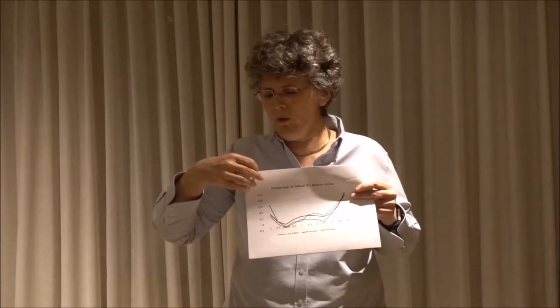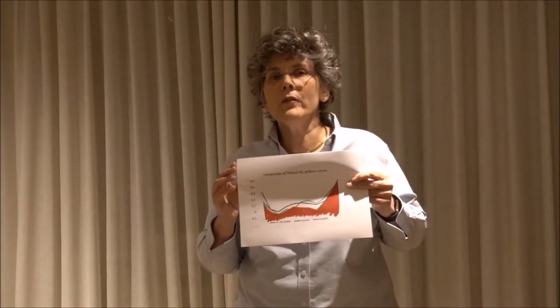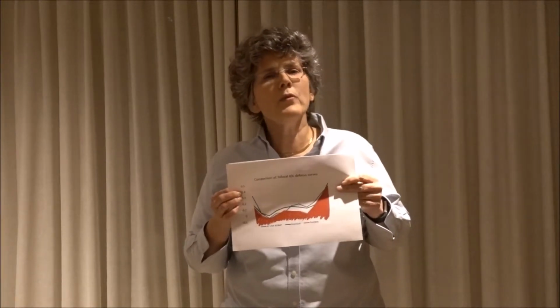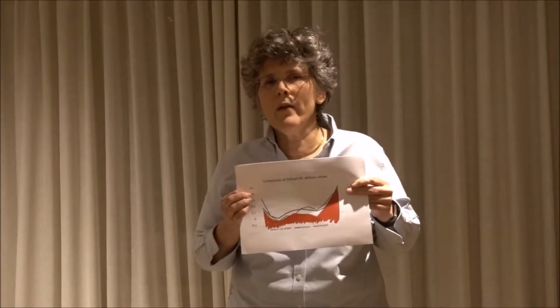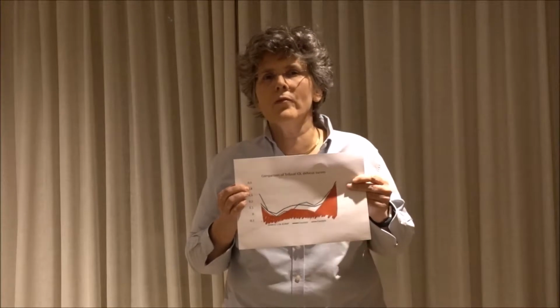So we wanted to solve this, and one of the methods in which you can solve such problems is to decide that you want to go for the area under the graph. Here I took the same graph and I filled out the area under the graph for one of the lenses. And then we came to the conclusion that functional vision is between +1/2 diopter until -3 diopters, because you can do a defocus curve from +4 diopters, but that's not functional vision.